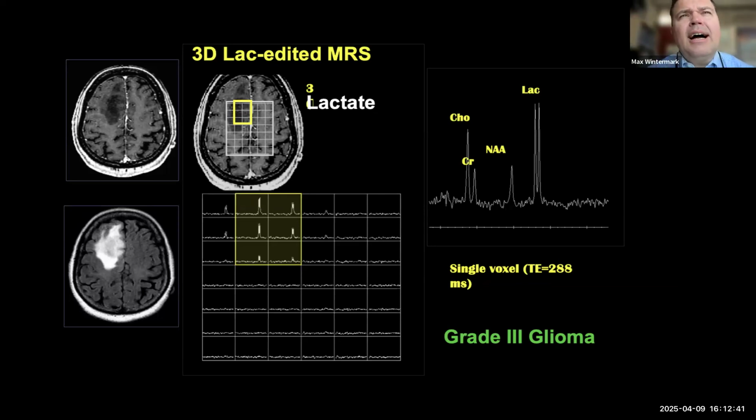Yes. So again, I don't know that I have an exact number, but to be realistic, first you have the patient time course, because you know when they got their surgery, when they started getting chemo and radiation, and there's a certain timing of radiation therapy changes. So that of course helps you. We also look at the pattern of enhancement, because if it's very feathery and there's not a lot of mass effect, that may push us more towards radiation therapy changes, whereas if there's more bulk-like enhancement, that's going to push us more towards tumor recurrence.